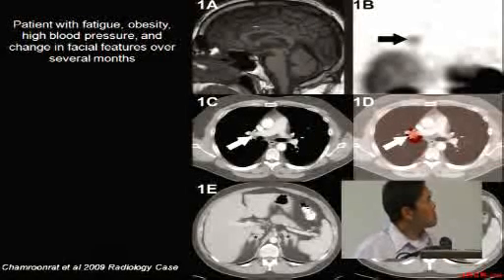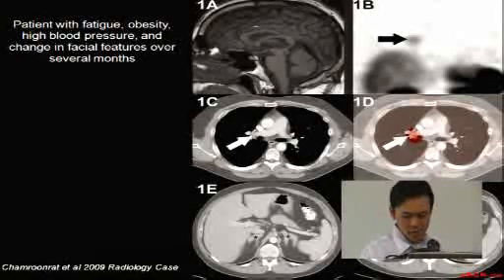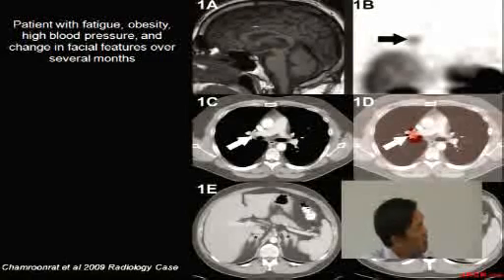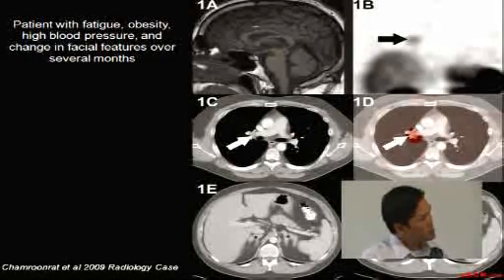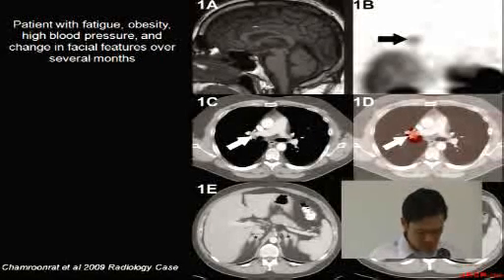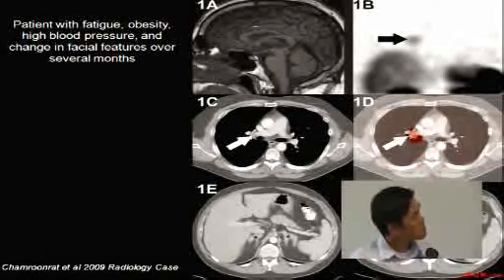Most internists, when you see this kind of constellation of symptoms, you realize it's kind of a Cushingoid presentation. And so the standard workup consists of multiple types of images, and I thought this was a good case to show because it shows all the different types of imaging that go into diagnosing a neuroendocrine tumor.